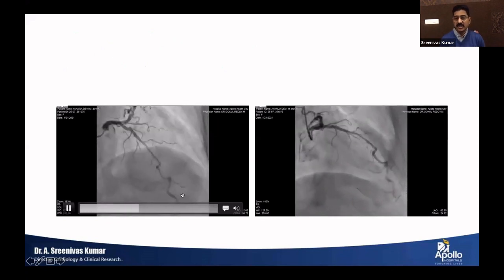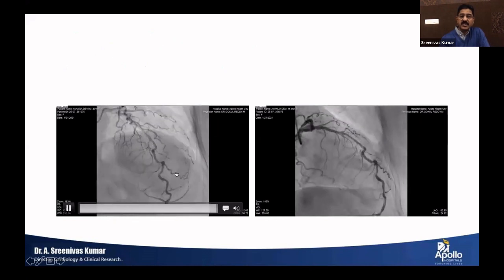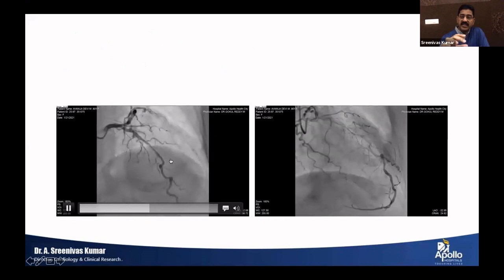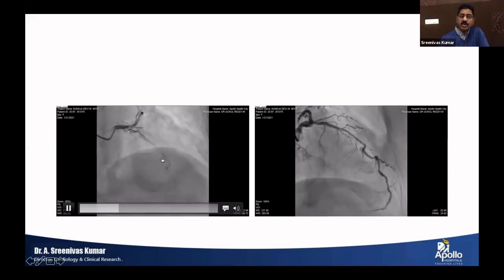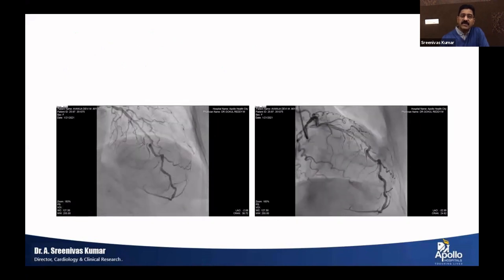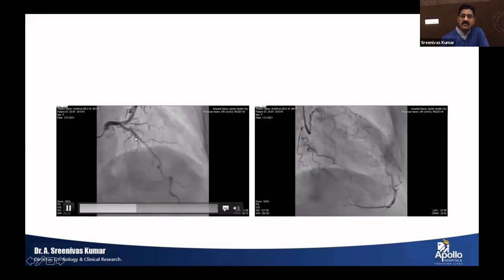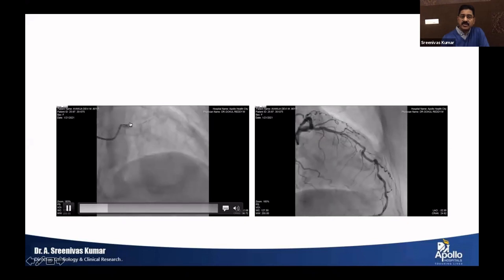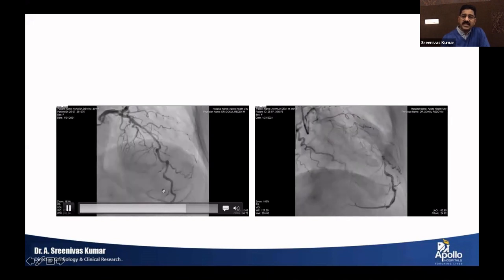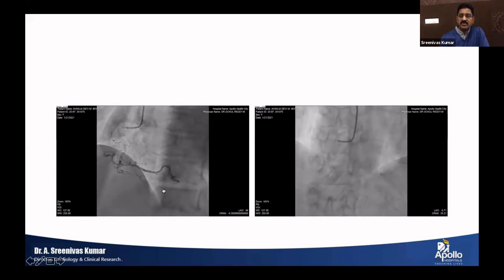And when you're dealing with such tortuosities, another problem is the concertina effect that happens when you are placing the wire, and everything gets into very focused narrowings. So you need to identify for yourself the proximal point and the distal point where you have to place the stent, so that the branches could serve as landmarks for you, even if the anatomy gets kinked with the concertina effect. That's how you should try to identify these marks. And always, when in doubt, get back the stent image with the contrast again, and place it while contrast is being injected. Right, that one is all right in this lady.